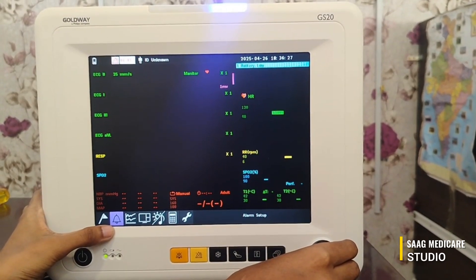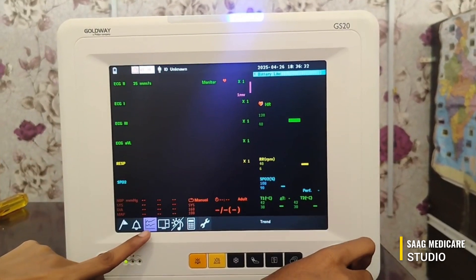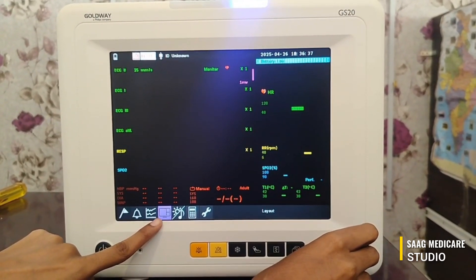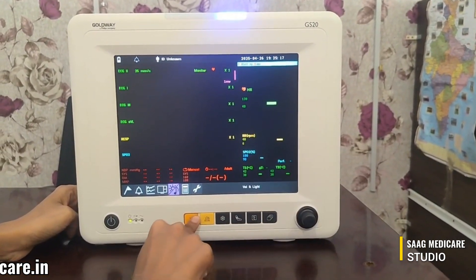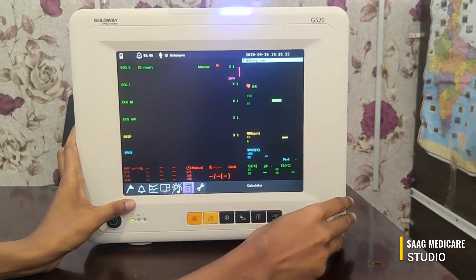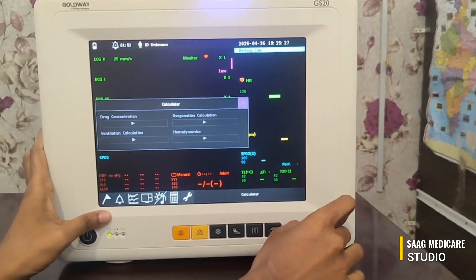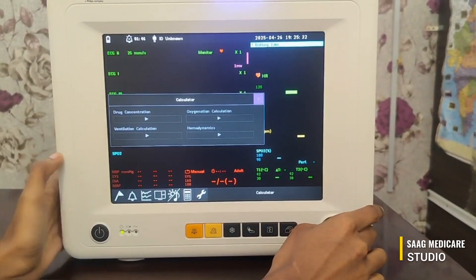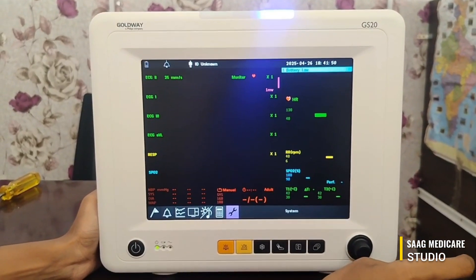The home page indicator is shown here. The second option is for setting alarms. This is the trend graph — press here to view it. This is for layout settings, and this adjusts the volume and brightness of the machine. There is also a drug calculator: if the patient needs a drug, oxygen, or ventilation, the machine will calculate the required value based on the measured parameters. The last option is for maintenance.